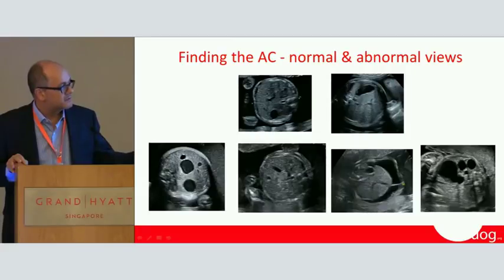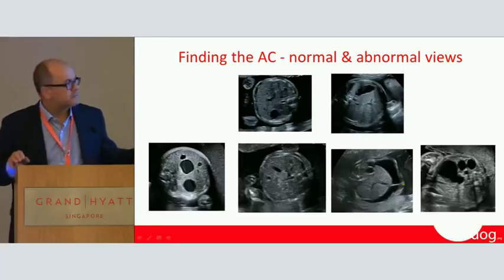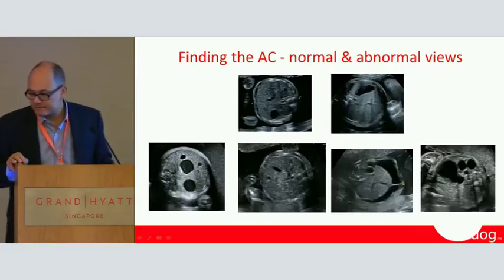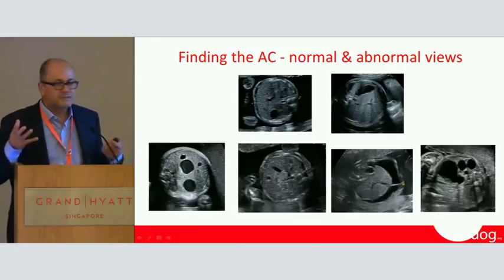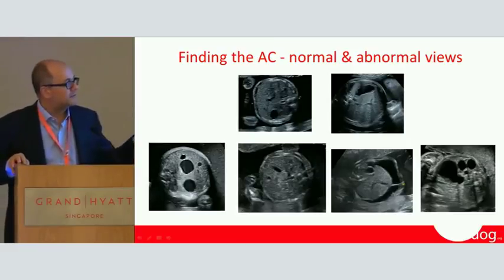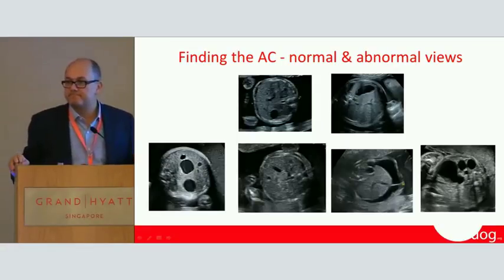What's the problem here? There's a stomach. There's the umbilical vein. What's the problem in that baby? There's some black stuff inside the baby. Yeah? Can you see that? And that's fluid. It's called ascites. So there's some ascitic fluid. And here you have another obstruction of the bowel. So most of the things when you look at abnormalities of the AC is you look for abnormalities of fluid. So you have extra fluid or not enough or in the wrong place. Okay?